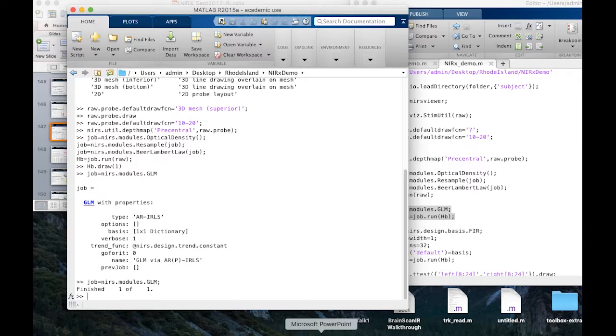And this is like 10 publications being expressed in 2 sentences. It turns out that noise, physiology, motion, et cetera, is bad for 2 reasons. One, noise is just bad. If you had less noise, you'd have better data and be able to see smaller effects, right? Two, every time you do a statistical model, you make certain assumptions. So you run a general linear model, you're assuming the data is normally distributed, stationary, IID, et cetera, that it's uncorrelated. And the problem is our data is not. Our data has outliers because it has motion artifacts. It has slow drift because it has all that physiology, which means that the basic statistical model is actually wrong, because it assumes your data fits these assumptions, and those assumptions are violated.